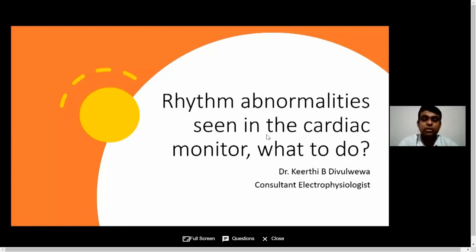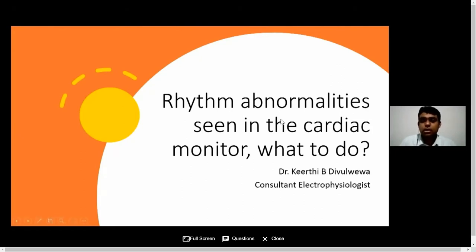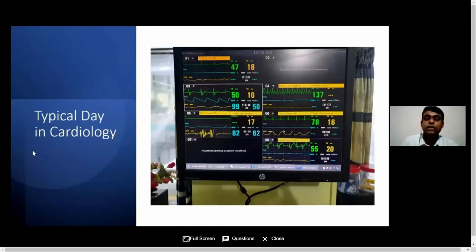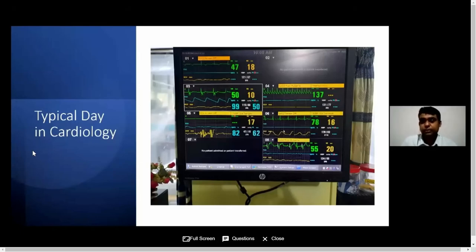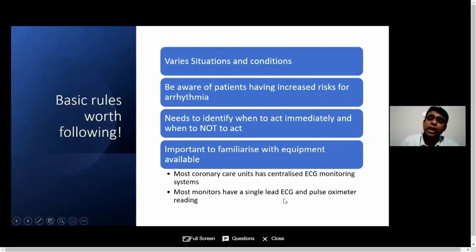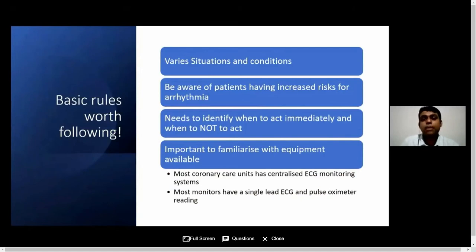Today the topic I am going to discuss is the rhythm abnormalities seen in the cardiac monitor — what to do. This is a typical day in cardiology. If you see all these monitors, you can see various types of abnormalities displayed. These are the basic rules we follow in this type of scenario in order to treat our patients, pick up their abnormalities quickly, and attend to them as early as possible in order to save a life.